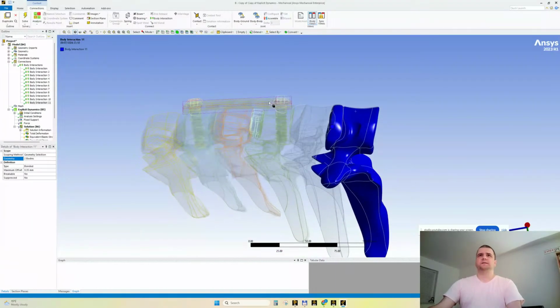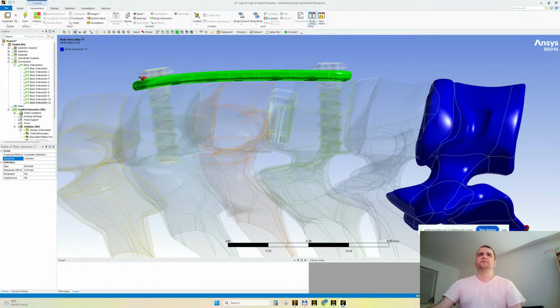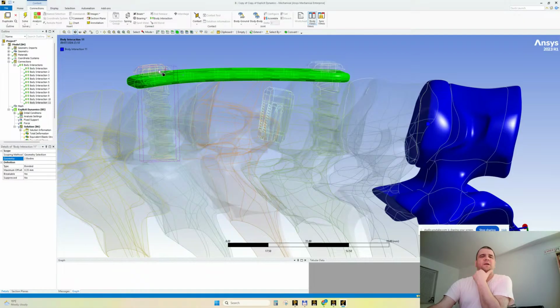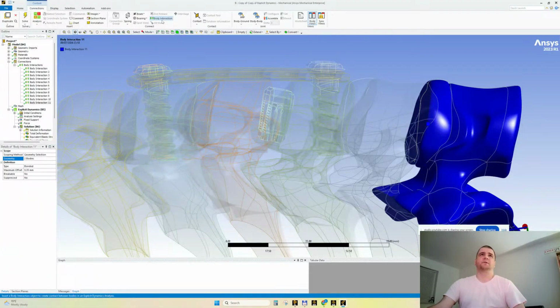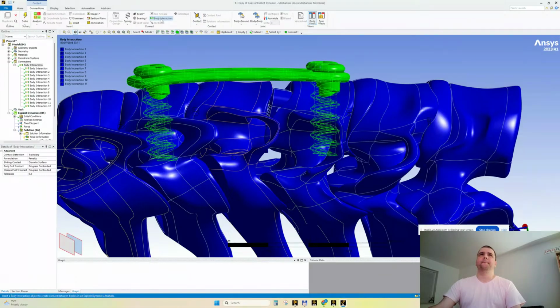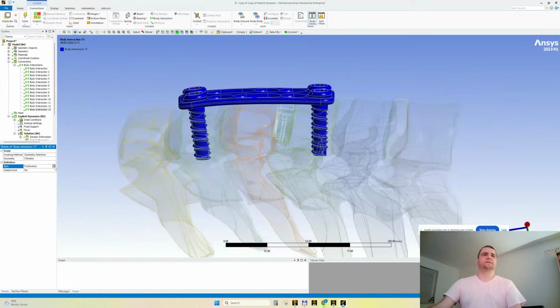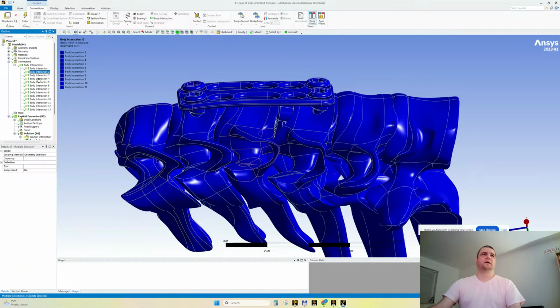So now what is left for us is to deal here. The question is, will I leave this frictionless? Or I will say, you know what, I will say that all these are bonded here because they are very tightly screwed. Yes, it's screwed so tight that these are bonded. This is what I will pretend, okay? Perfect. So I said bonded and 0.35, why not? Maybe I need to decrease a little this value. Should I decrease it or not? Aren't they bonded?